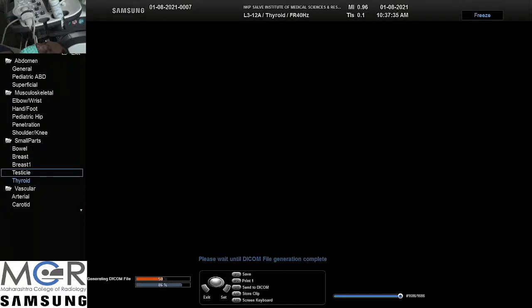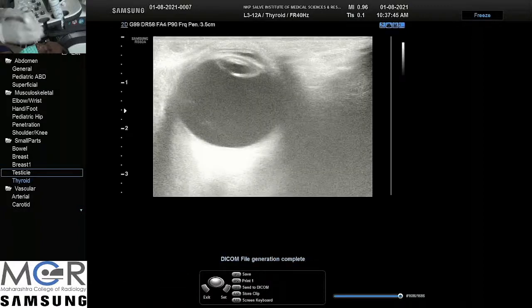Okay, auto save is happening. Yes, but what is happening? Okay, now we are ready.